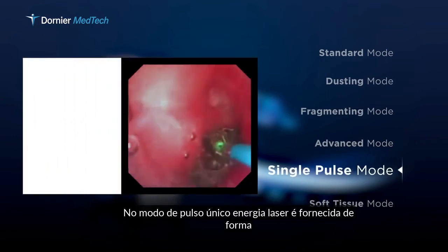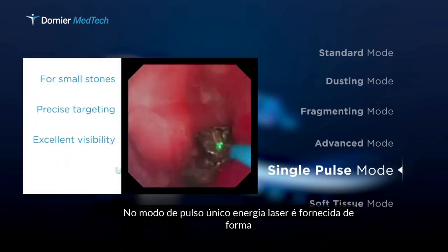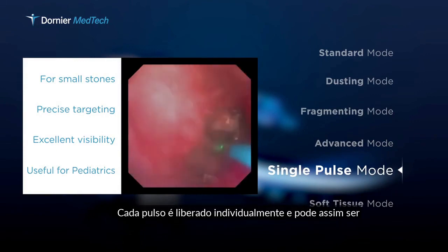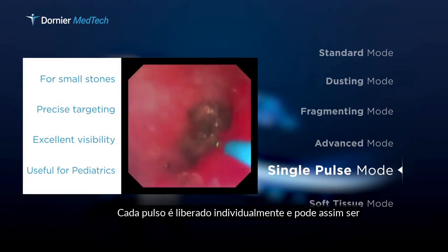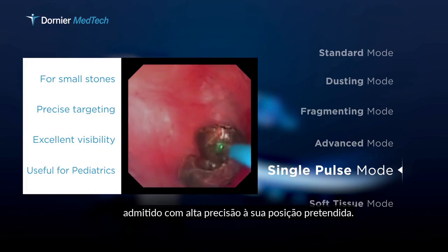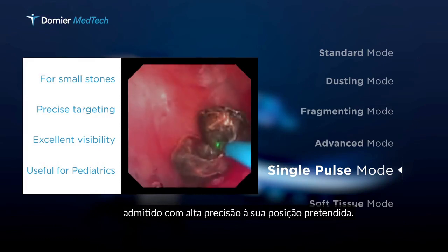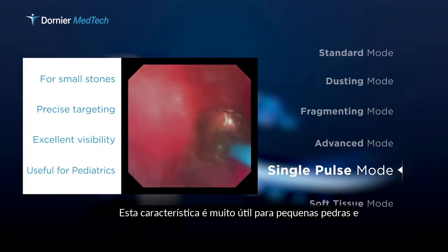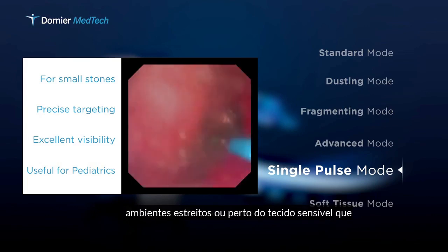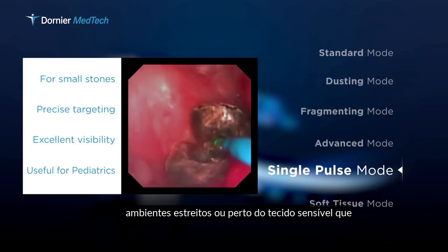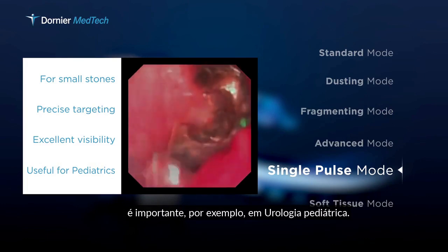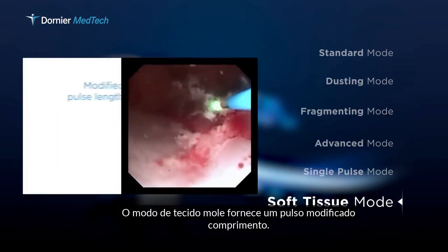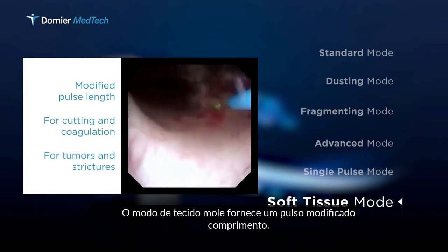In the single pulse mode, the laser energy is provided in a very controlled and careful way. Every pulse is released individually and can thus be emitted with high precision to its intended position. This feature is very useful for small stones in narrow surroundings or close to sensitive tissue, which is important, for example, in pediatric urology.